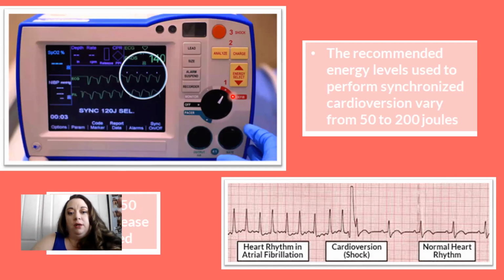Put on the pads, put it on defibrillate. You have to hit sync because that's how the monitor knows when to shock. And then I'm still going to charge, and when this lights up, I'm still going to shock. So it's all kind of the same process. Everybody clear of the patient. Patient's not going to like it. But the idea is that when I throw that shock in there, it's going to reset.